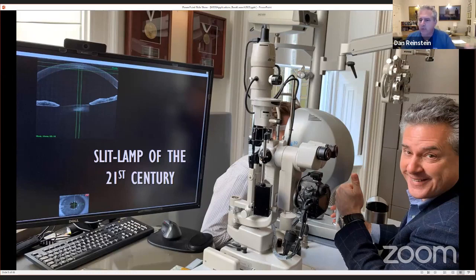That's obviously, you know that. And for me to be able to examine a cornea exactly the way I want, at which angle, and then make some measurements and come back and look at it again and look at something else. As you will see in my curious case at the end, you will understand what I'm talking about. So for me, this is almost an essential tool for the refractive surgeon.